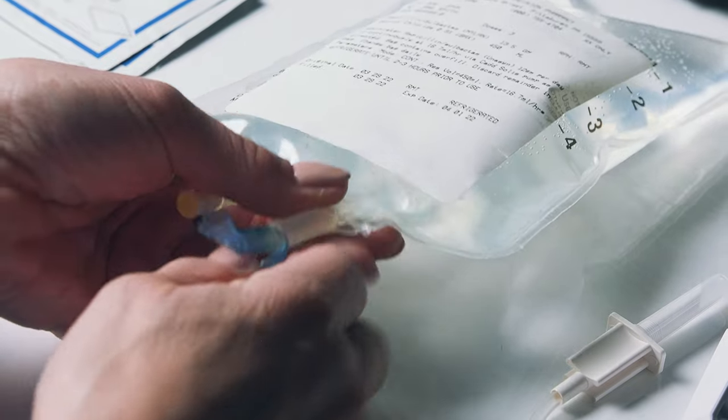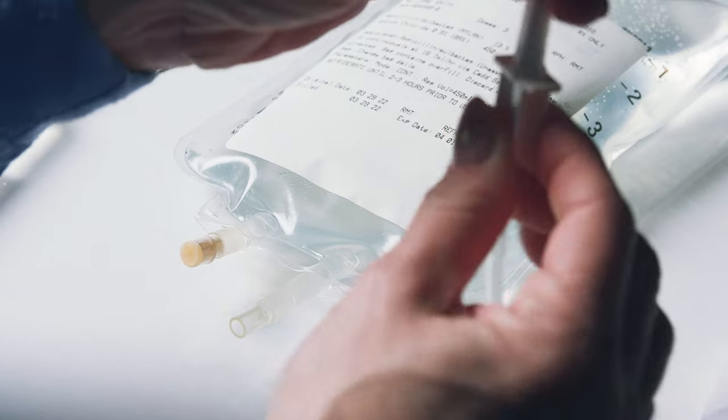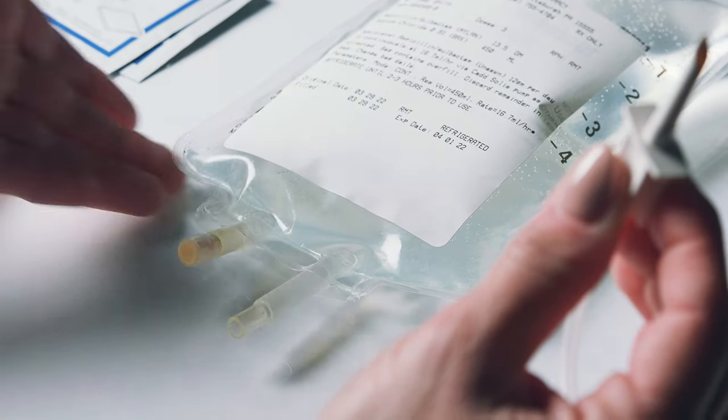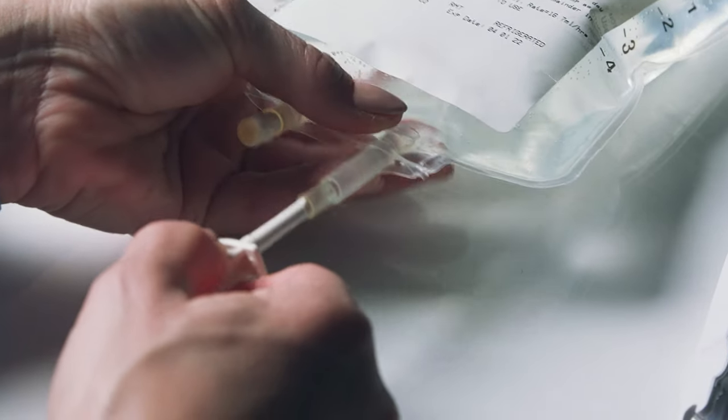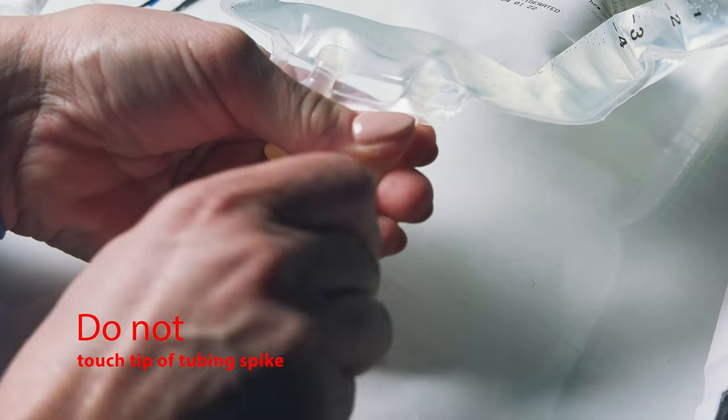Remove the protective tab from your medication bag's tubing spike port. Remove the cover from the tubing spike, then insert the spike into the entry port using a pushing-twisting motion. Be careful not to touch the spike.